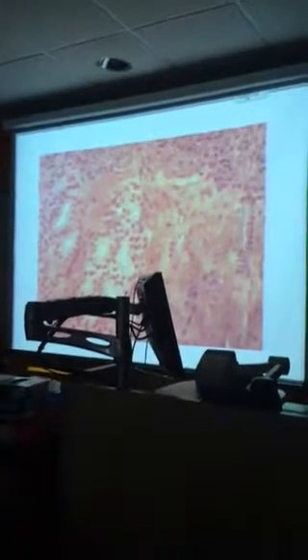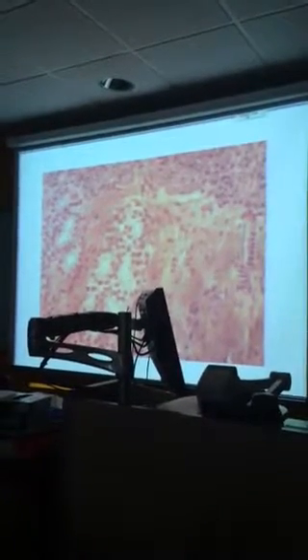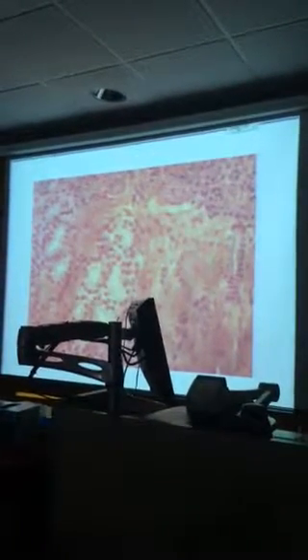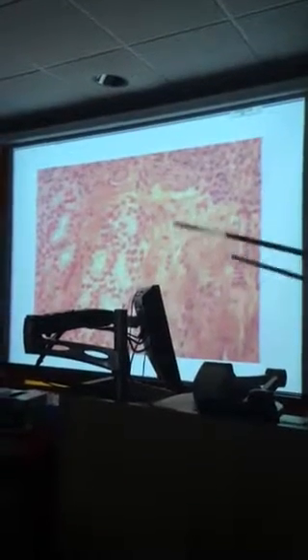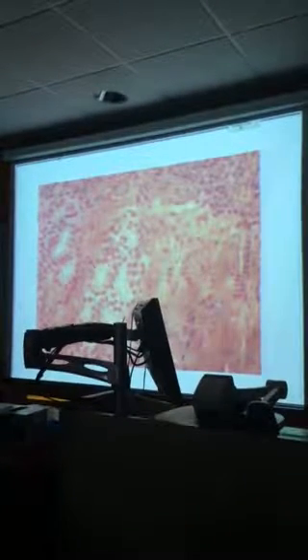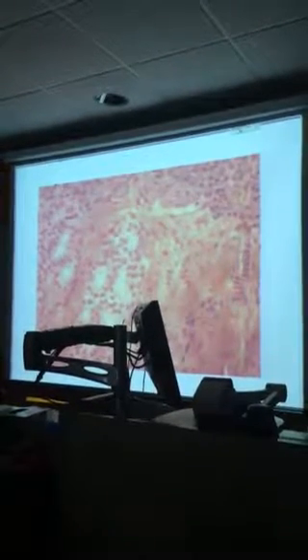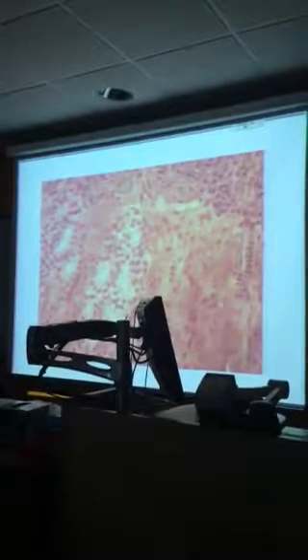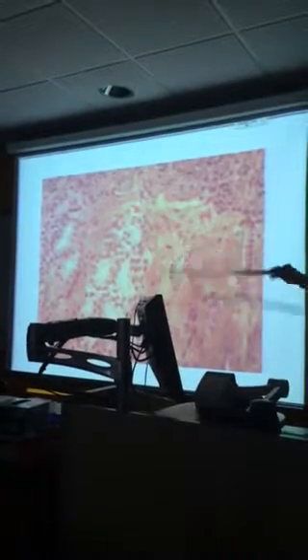Why do you want a basic secretion going into the small intestine, in the duodenum? What's coming into the small intestine? Chyme. And what is chyme? An acidic paste, very acidic. The digestive enzymes in the small intestine do not work well, if at all, in an acidic environment. You'd end up denaturing your enzymes. So you first have to bring that pH up to a workable level, which is usually neutral or slightly basic. That's the purpose of the secretion of these Brunner's glands, or duodenal glands. You can see the submucosa is just full of these glands.